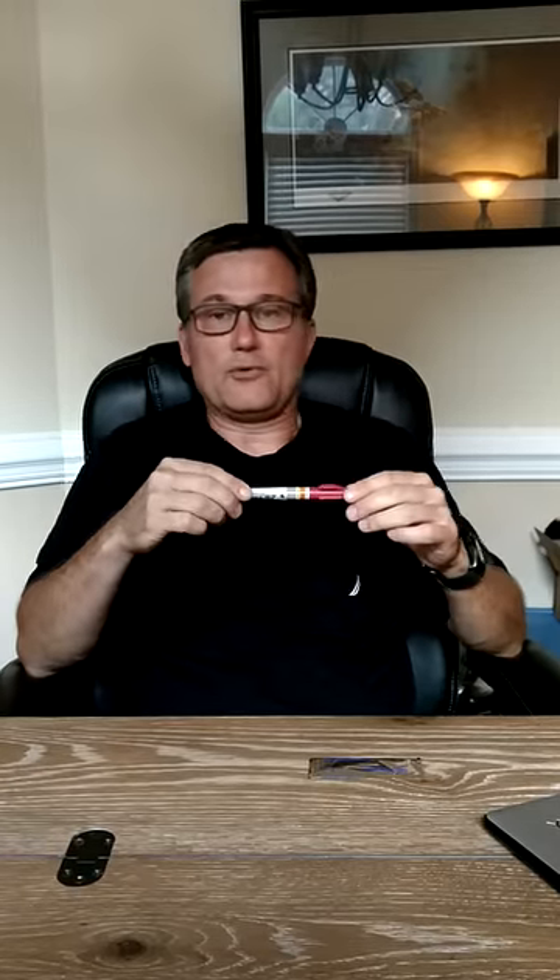Today I'm going to talk about catheter selection for needle decompression. I'm going to talk about this one — it's from North American Rescue.